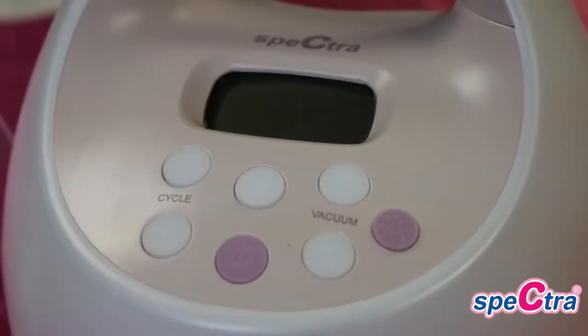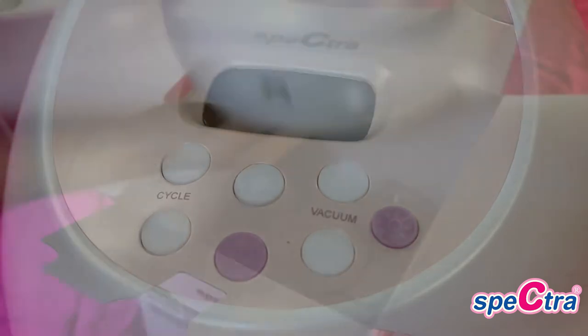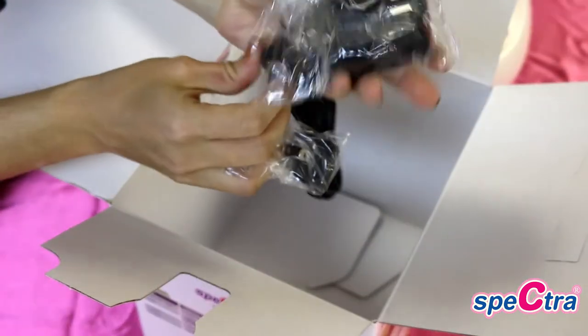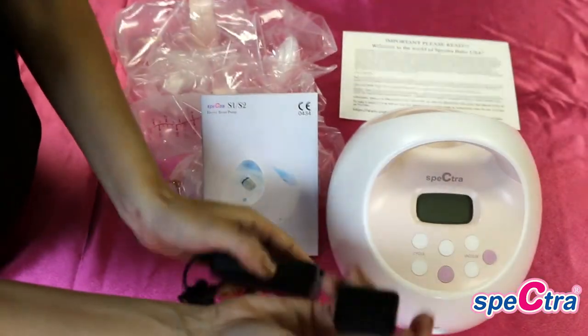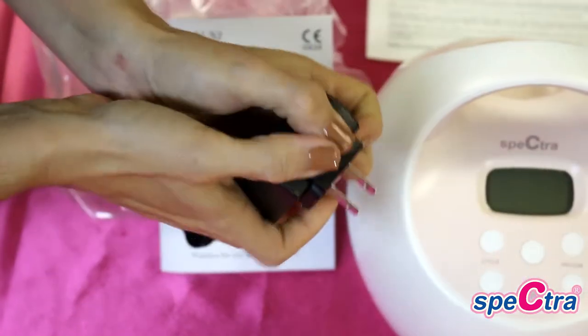You will then find your Spectra breast pump sealed in a wrapper — this will be the Spectra S2. In the bottom you will find a power cord as well as a prong adapter. You will start by taking the prong adapter and snapping it into the power cord until you hear a loud click.